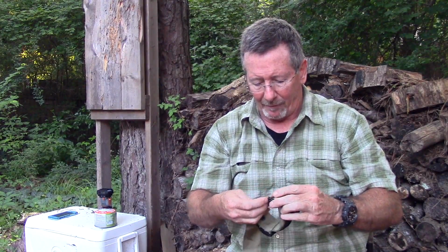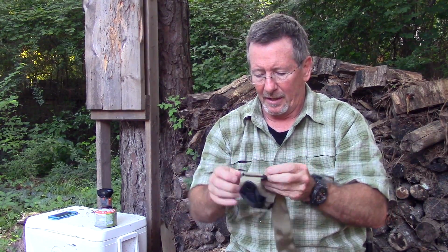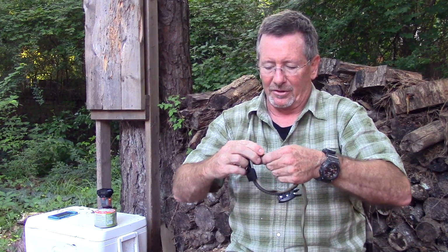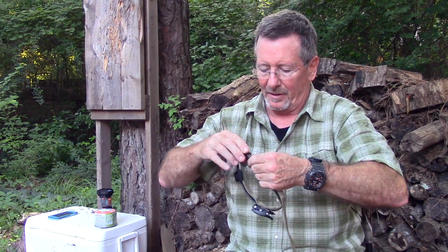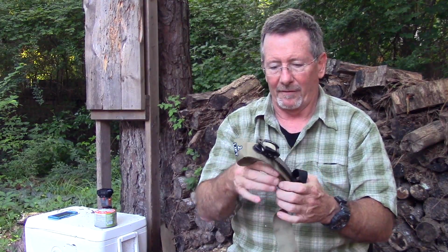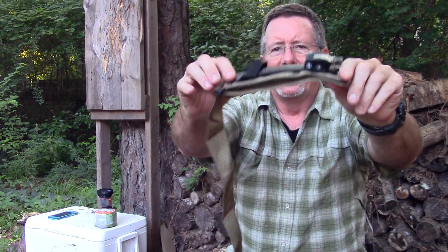The other issue I have with this one, and look, this is a great tourniquet. I'm not knocking the tourniquet, but for everyday carry, it's just too big. And as you can see, loosening it up when it's tight like this is not really a piece of cake either. But once you put it on, you're not going to take it off anyway until you get to the emergency room. So they could probably cut it off if they had to.